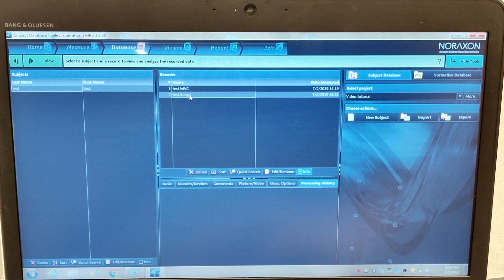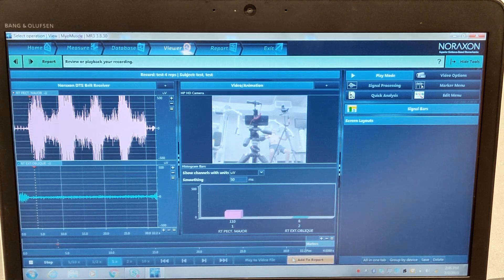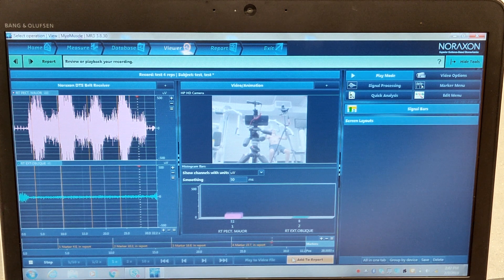Now that we've got our MVC, we're going to process our four repetitions. We'll double-click that to bring up the screen — this signal is also somewhat messy and we want to clean it up; it's still the raw signal. We'll hit Play, which will play the video in the middle of the screen as well as the timeline for the signals. We can then mark the start and end of each repetition. Watching for the start — that's one, and that's the end; end again; done; last rep; done.